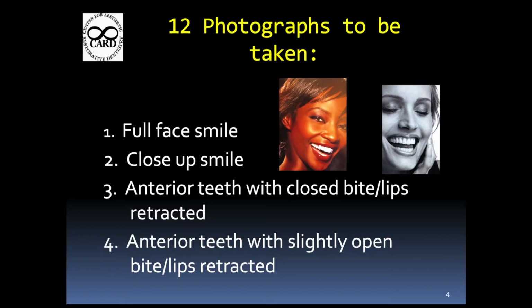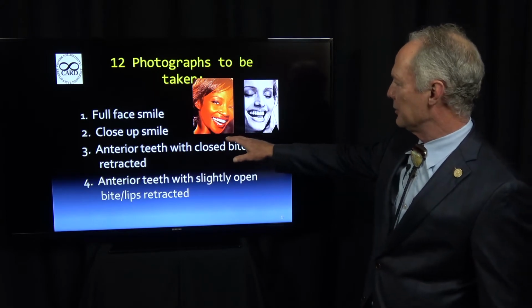Now this is not a cell phone, this is not a Polaroid, this is a high-end diagnostic camera. These photographs have got to be outstanding. So these are the 12 photographs to be taken.